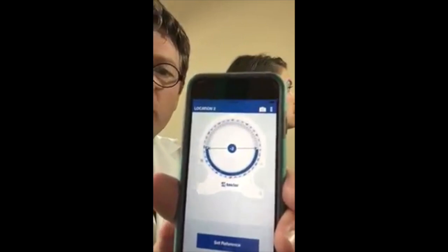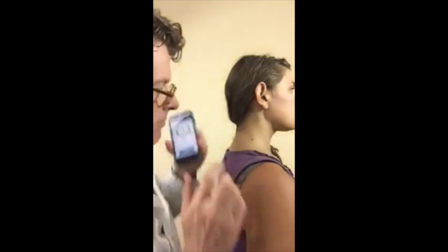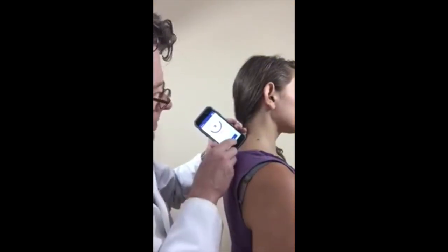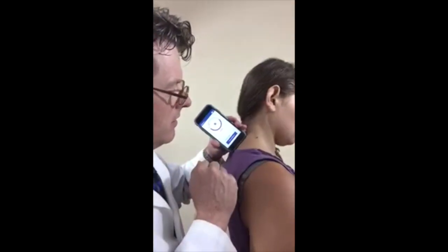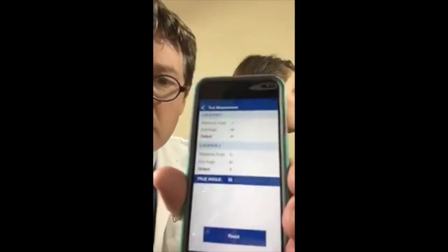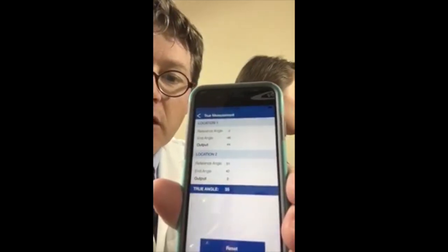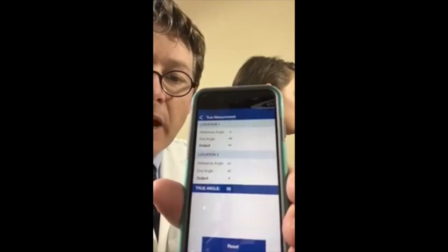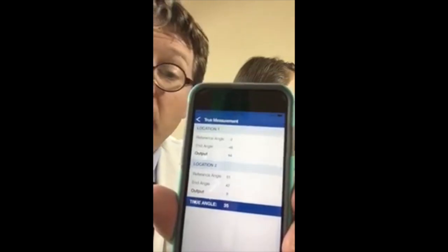I put the device at location number one at the terminal flexion point and hit take measurement. You can see that now it has moved to location two asking us to set reference. I'm now going to set the device at C7 on her neck and set reference. Now ready to measure — go ahead and flex your neck again — and I'm now taking the second measurement. Now you can see that the Ratefast dual inclinometer has automatically done calculations and returned to us a true spine angle flexion: 35 degrees. Simple as that.